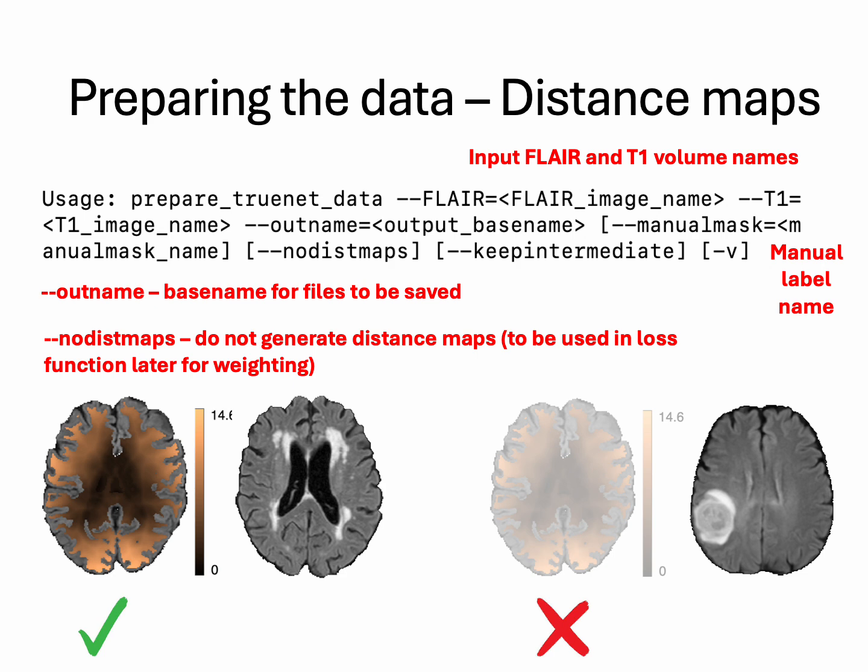There are some use cases where that can be quite useful. The first is where you use the distance map for hyperintensities, because the deep lesions occur farther away. There are also use cases where we use TrUE-Net for brain lesion segmentation, for instance brain tumor segmentation. There is no spatial prior, no study to support that brain tumors occur in a certain region of the brain, so they can happen anywhere. In those cases the distance map really doesn't make sense. So for any other application, please feel free to add this no distance map flag, and the distance map will not be estimated.